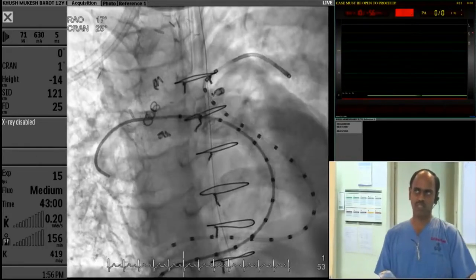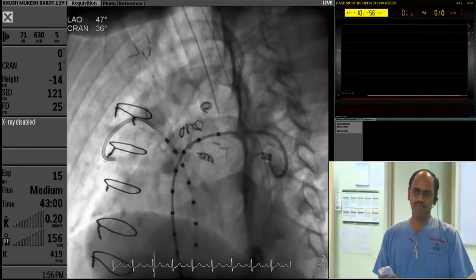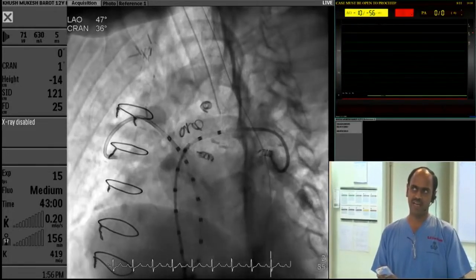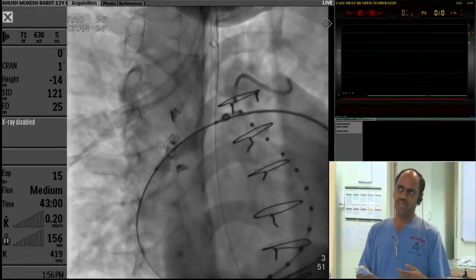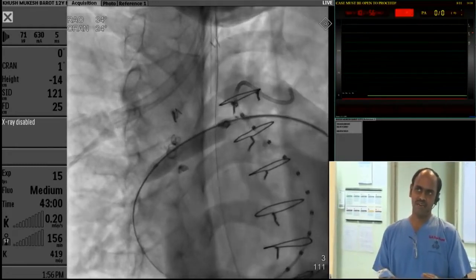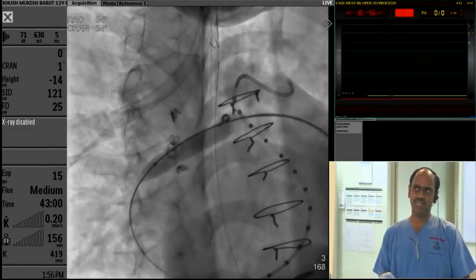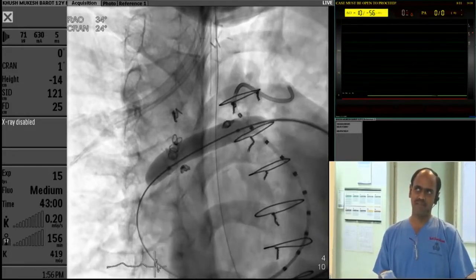The right pulmonary artery angiography shows severe narrowing — it is actually partly a Gore-Tex patch. The left pulmonary artery shows again severe ostial and hilar narrowing. We then put a balloon into the right pulmonary artery and dilated it. This is to check compliance as well as create a pathway for our stents. This is the right pulmonary artery dilatation with a Mustang 10 mm balloon.